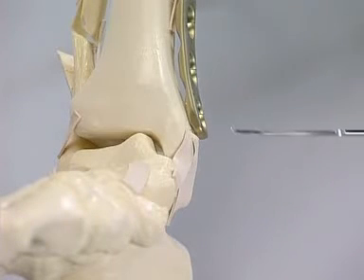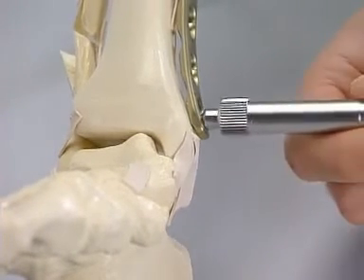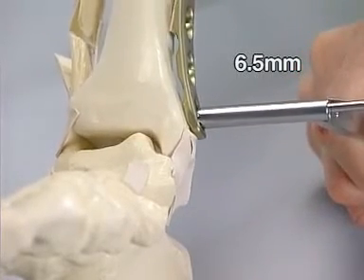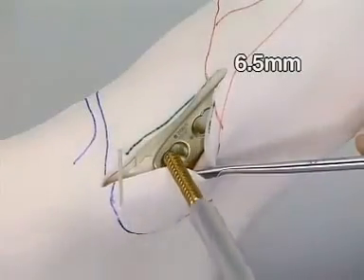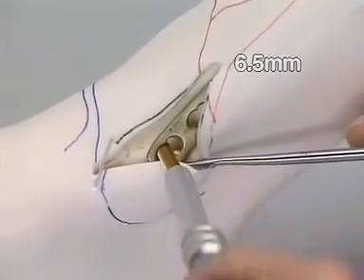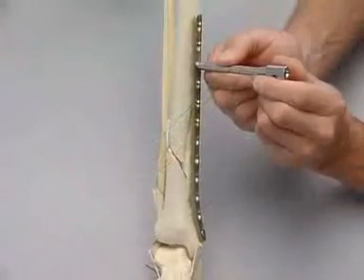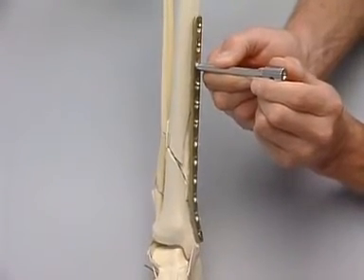The depth is measured. The thread is cut with the 6.5 mm tap for cancellous bone screws. And the cancellous bone screw with continuous thread is screwed in. The screw is still not completely tightened. This allows the definitive reduction of the fracture in regard to length, axis, and rotation.